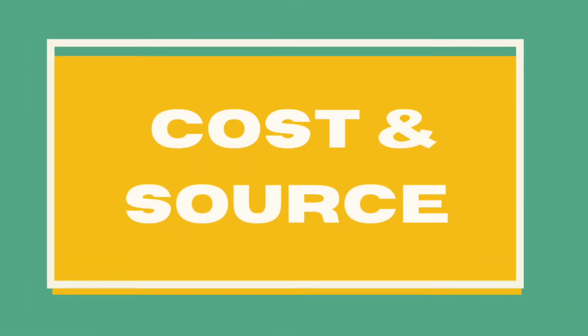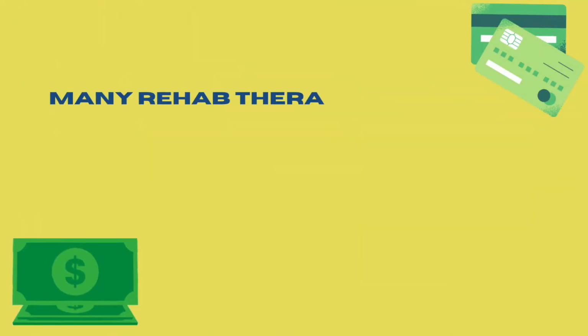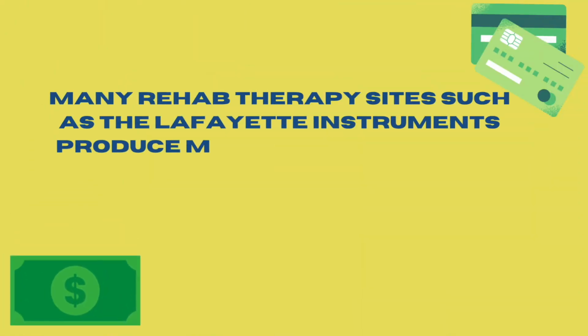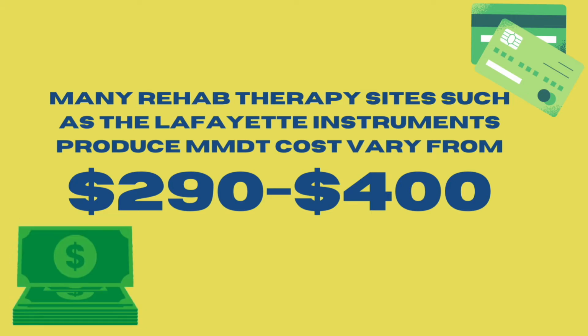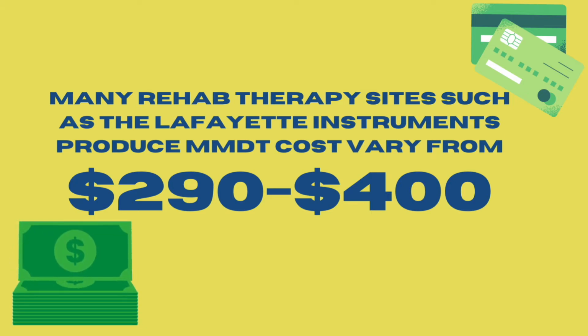Cost and source. Many rehab therapy sites, such as Lafayette Instruments, produce the MMDT. Cost can vary from $290 to $400.